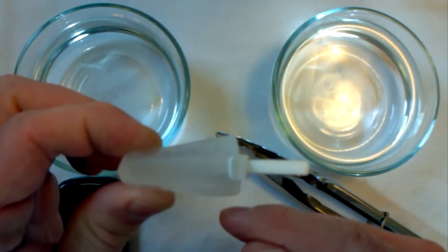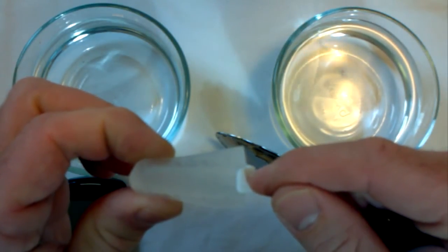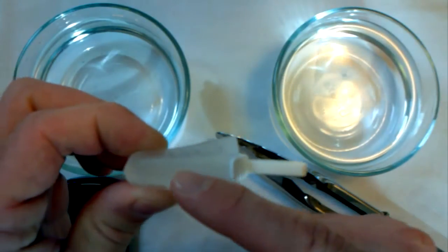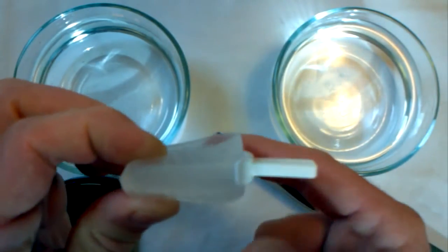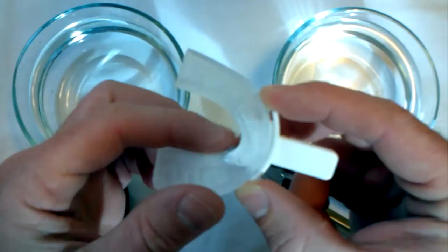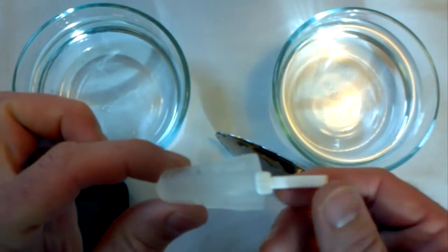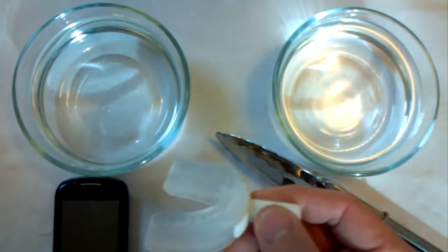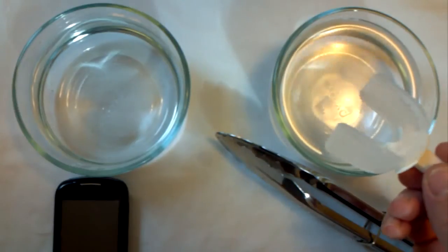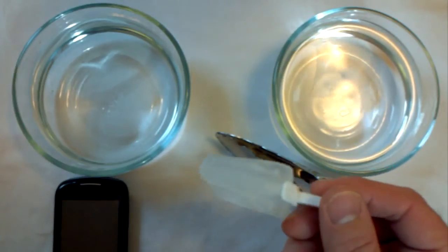While you're doing this, you're going to notice that this piece of plastic here is going to raise up slightly, like so. And while you're doing that, you're going to reach inside your gums here. You're going to push down, forming around your teeth right in this area, and then use your tongue on the inside to push in and form around your teeth around here. This process is going to take about a minute or so, and then at the end of the 1 minute, you're going to take it out of your mouth and drop it into the cold water. And this is actually going to help set up the mouthpiece. Leave it in there for about a minute or so, and then take it out, and you can check the fit to see whether or not you had a success.